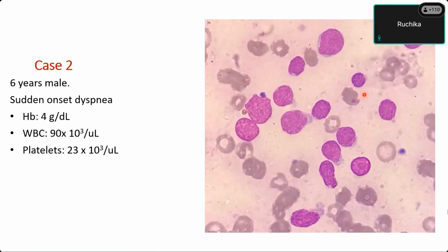Don't worry. The chromatin is opened up. This is a lymphocyte. In comparison to this, you can easily stuff around 3 lymphocytes in this cell and 2 in this cell. So there's a heterogeneity in size. These atypical cells or blasts are 1.5 or 2 to 3 times the size of a mature lymphocyte.